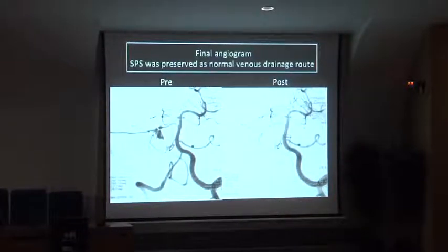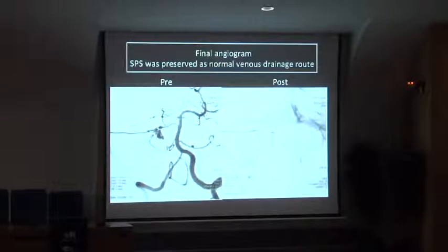Final angiogram. AVM has gone. SPS was preserved as normal venous drainage route.